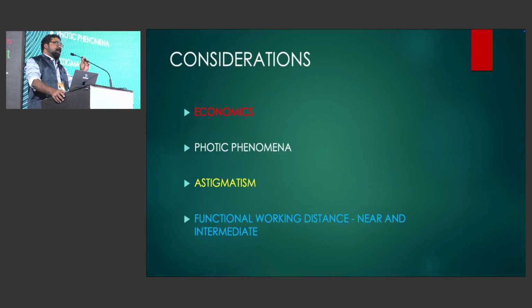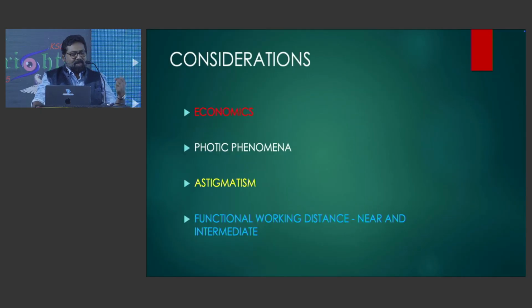Coming to the material, I don't think we should emphasize any more, because hydrophobic acrylic is the lens of choice, and with the Indian companies coming, it has become very affordable. So the considerations about selection of an IOL: one is the economics. After all the good work done during the phaco and all the other steps, the IOL should help improve the vision to the best extent. So economics is one criterion. Like I said, Indian companies have now come with good IOLs.